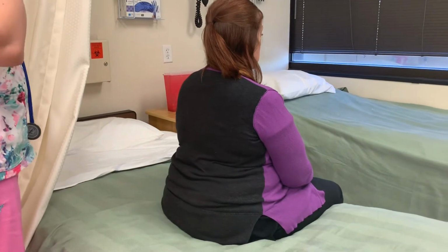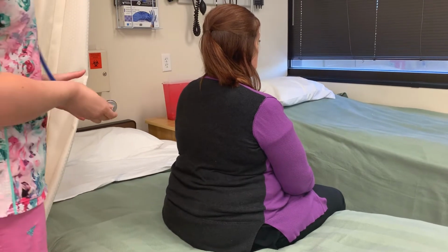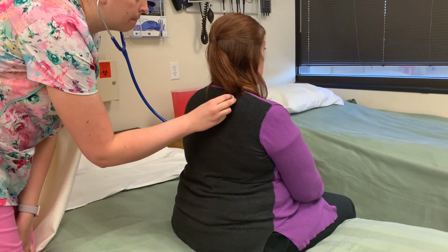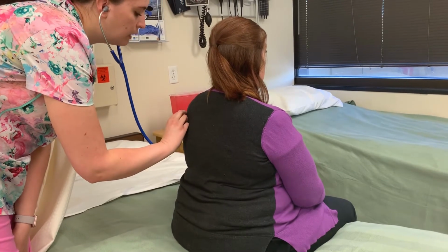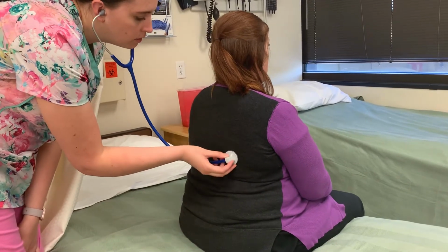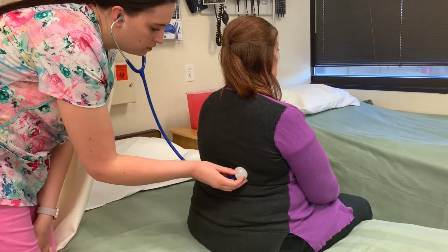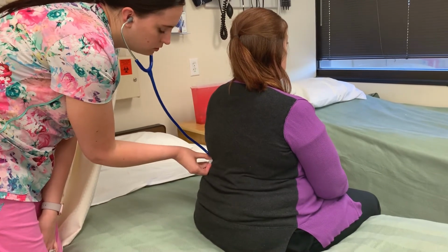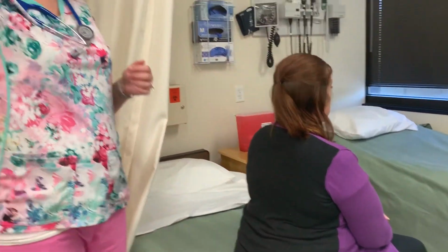So Shannon, each time I move my stethoscope, if you could please take a deep breath in and out for me. And I'm going to use the diaphragm of my stethoscope. Not moving on until my patient has taken a deep breath in and out. And I'm assessing upper lobes, mid lobes, and lower lobes. Perfect. Upper, middle, and lower lobes are clear bilaterally.